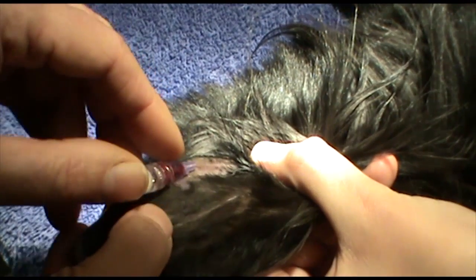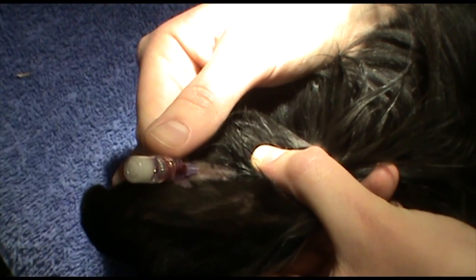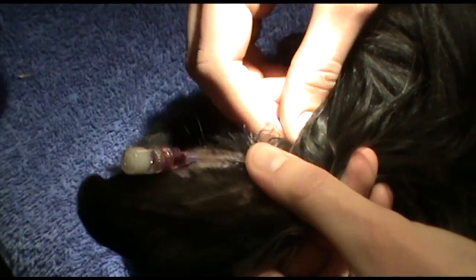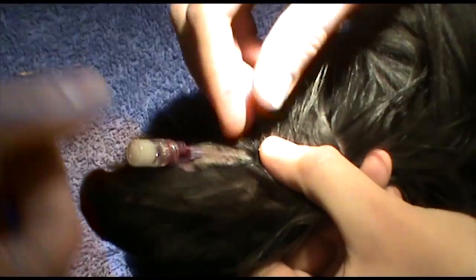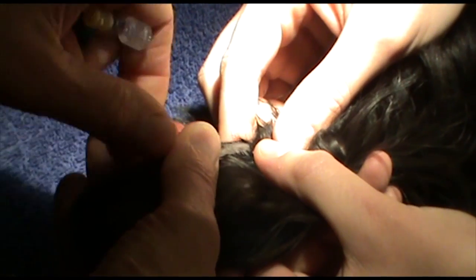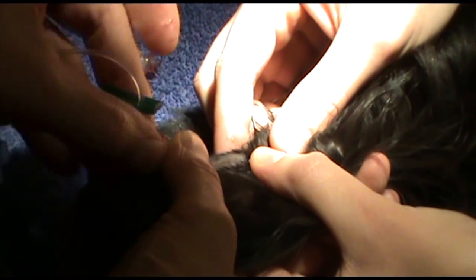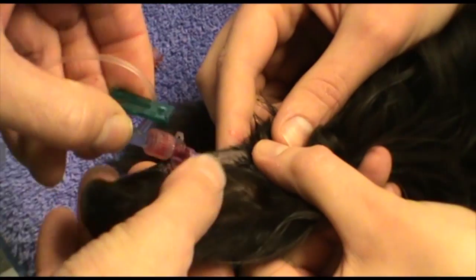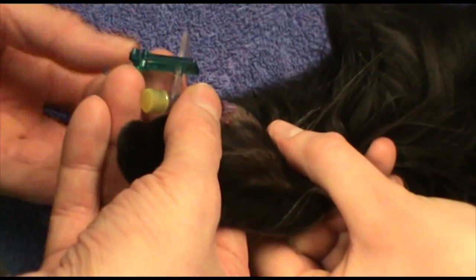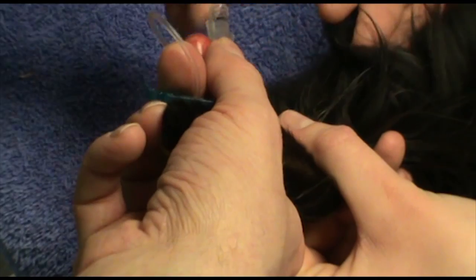We then tie the bung in to secure it there. What we do for these, if we're going to go through into theatre, is we actually put an extension set on. It just means when the rabbit is anaesthetised under the drapes, we can actually access this catheter from a distance away. The thing I've never known is how to secure a catheter to a rabbit's ear — you just see lots of tube and bolster under the ear to maintain the curve.